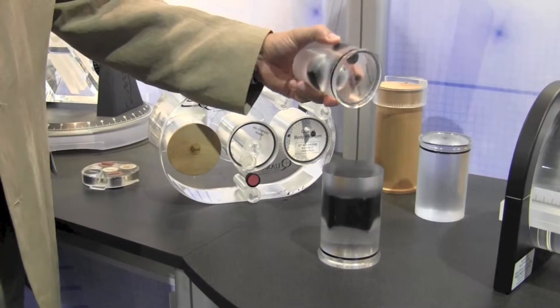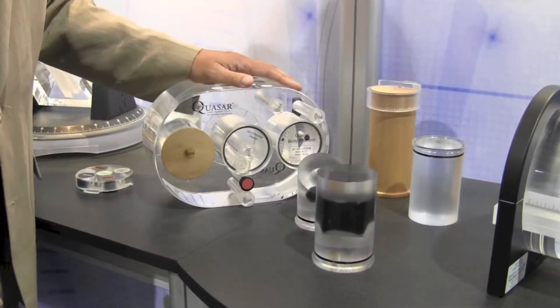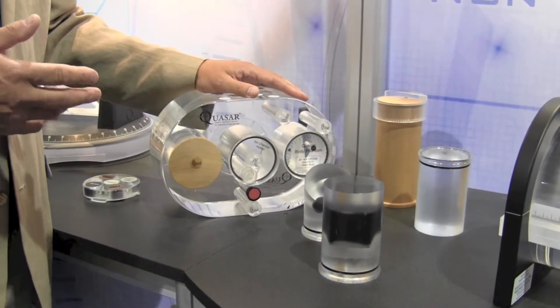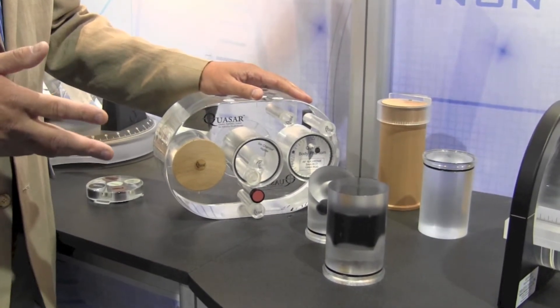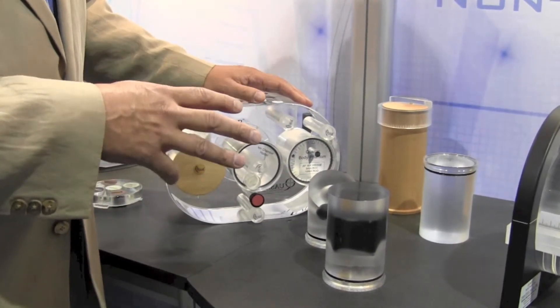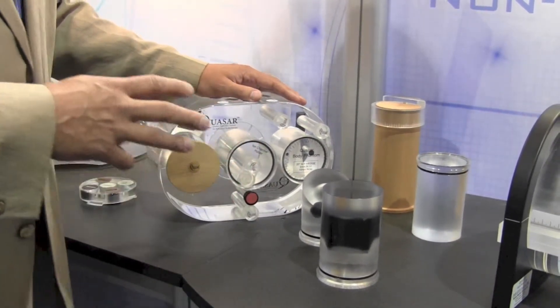These objects, when they're imaged, the images are taken to the planning system and there's a series of tests of planning system geometry and technology. These are published and address issues in TG53 and in TG66.